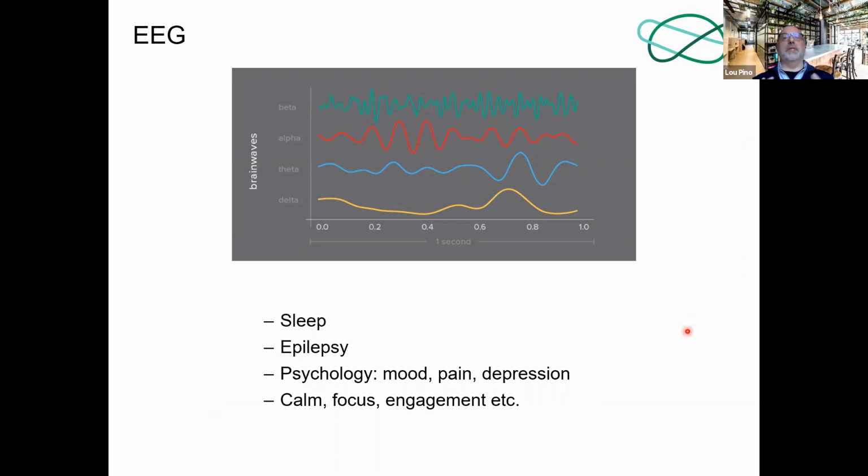In general, the larger the brain volume contributing to the voltage of all of these firing action potentials, the slower the frequency, and the smaller the brain volume that is contributing to oscillatory behavior is usually higher in frequency. Delta here is the slowest, and it's the strongest during deep sleep. Theta waves here are faster than delta, and like I mentioned, it's strongest during drowsiness.